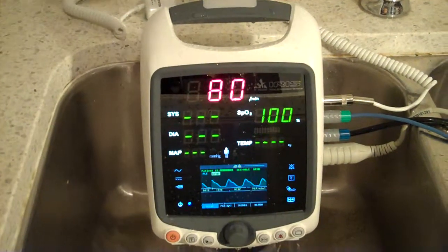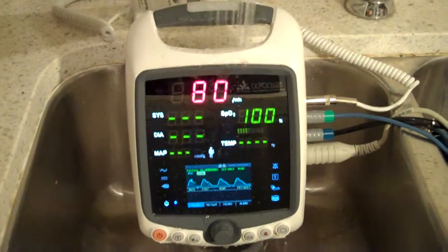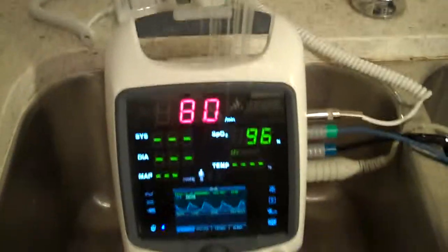Here's the demonstration. This monitor can also be connected to a central monitoring system with Wi-Fi, and it also can have a printer. It can save data using an SD card slot.